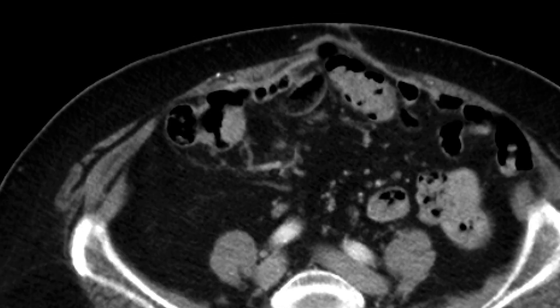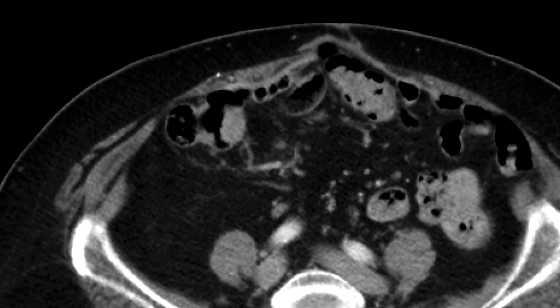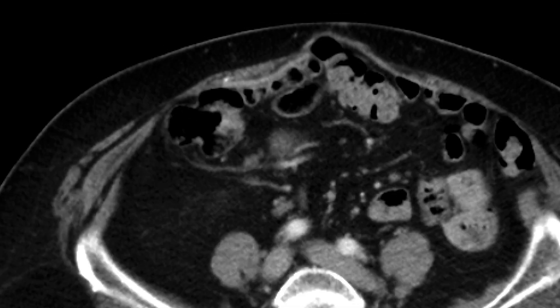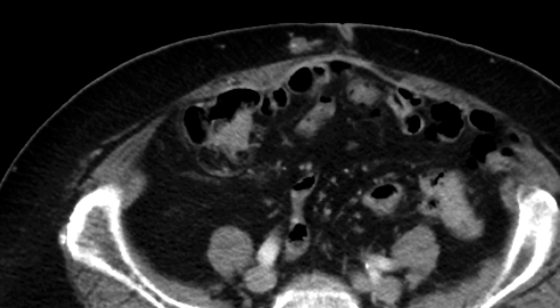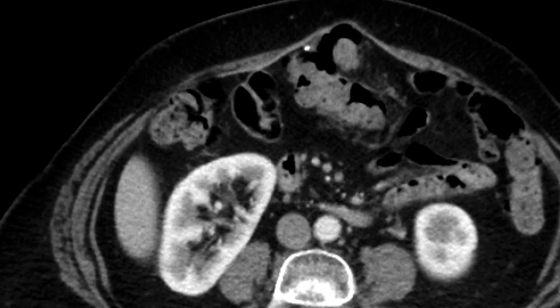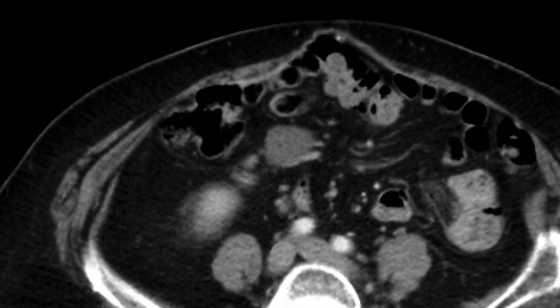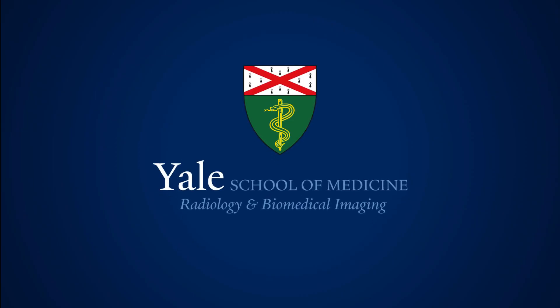If you look at it very carefully, the key finding here is that it's soft tissue attenuation, and that is quite asymmetric, and it looks a little bit mass-like as well. This was questioned as a potential either primary process in the colon, or, given the history of ovarian cancer, a serosal implant. And this ended up being a carcinomatosis serosal implant located right at the cecum.